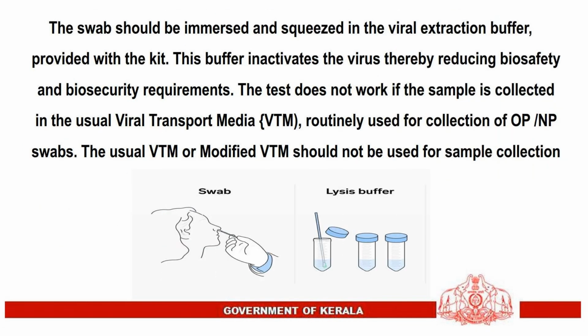The swab should be immersed and squeezed in the viral extraction buffer provided with the kit. This buffer inactivates the virus, thereby reducing biosafety and biosecurity requirements. The test does not work if the sample is collected in the usual viral transport media, routinely used for collection of oropharyngeal or nasopharyngeal swabs. The usual viral transport media or modified viral transport media should not be used for sample collection.